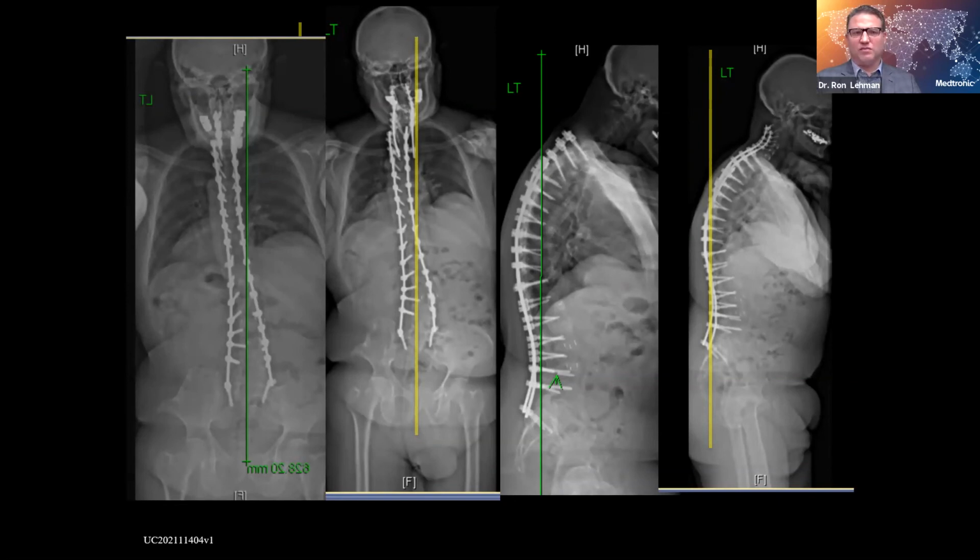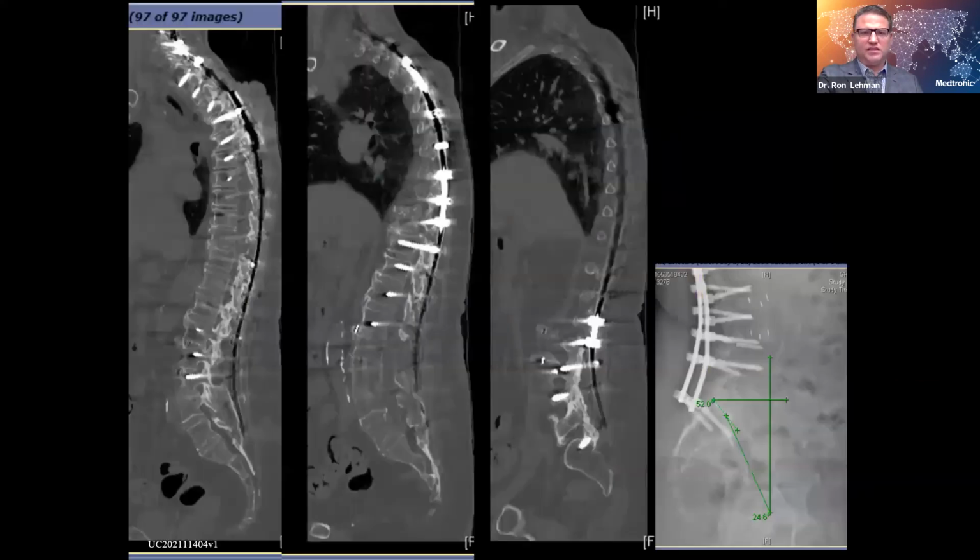He's like, Doc, even if I don't make it through the surgery, I can't live like this. So from that perspective, we decided to do his lumbar reconstruction, and looking at his CT scans, once again, we can see that he really is pretty solidly fused, at least posteriorly, and has multiple OLIF operations done, has some disc spaces down here, which are potentially targets of opportunity, but he has solid posterior fusion mass and has Bertolotti's here at L5-S1.